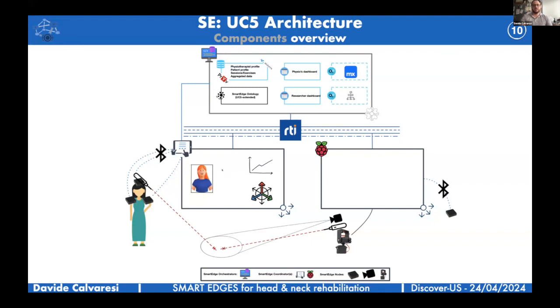On the screen of the tablet, there will be a 3D avatar that will serve as guidance for the patients but also as 3D monitoring that gives real-time feedback to show what they are actually doing and to close the feedback loop between doing and seeing themselves.